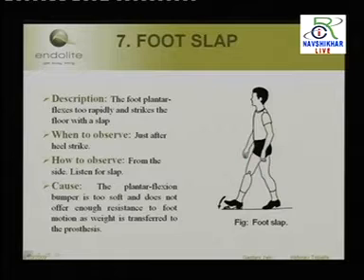We can see this immediately after the heel strike. When the patient strikes his heel, you can see whether the foot is normal or whether it is going into excessive plantar flexion, I mean the movement towards the ground. There is a certain degree at which, and a time at which, it should move. It should not be too soft, and it should not be too hard either. A certain grade of heel cushioning has to be provided in the artificial foot. That depends on the patient's weight, activity, and structure. Accordingly, we decide which softness of heel cushioning to give to the amputee.